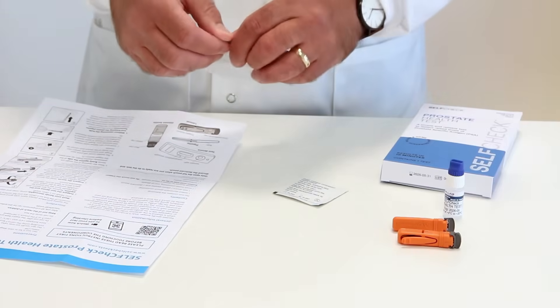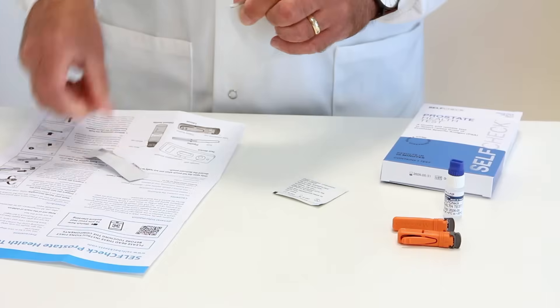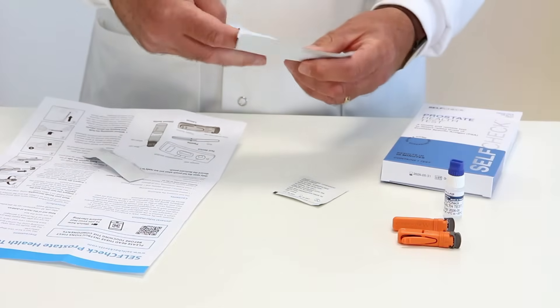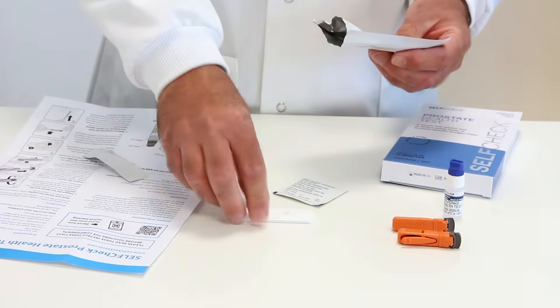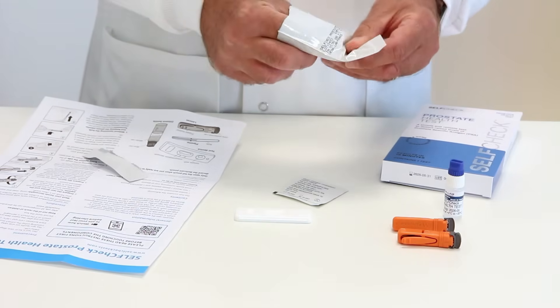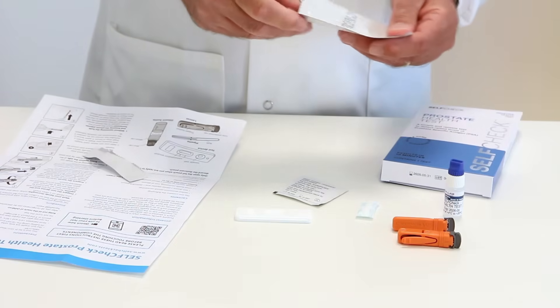Now, open the foil pouch. Inside the foil pouch, you will find the test cassette, a small sachet of desiccant which you can discard, and a small plastic pipette.